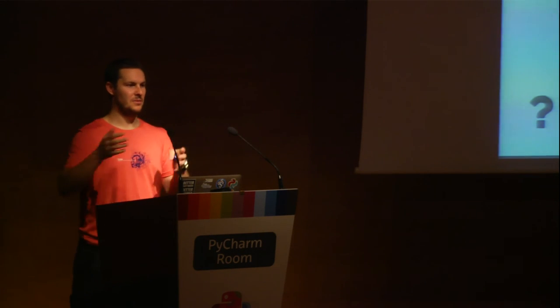So scikit-image is not really prepared for this. I mean, you can do it, but you are working with chunks. For example, if you run a smoothing with scikit-image, you need to know the voxel size, because I'm working in millimeters. There are some specificities where scikit-image wouldn't be practical, and so yeah, MATLAB is very used.